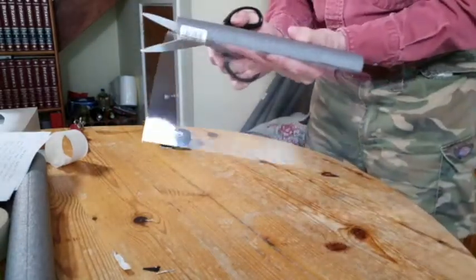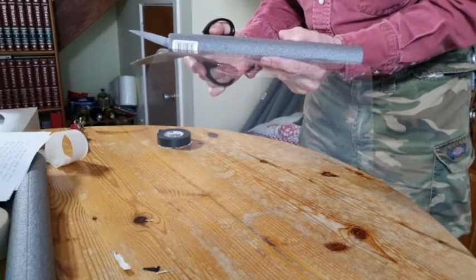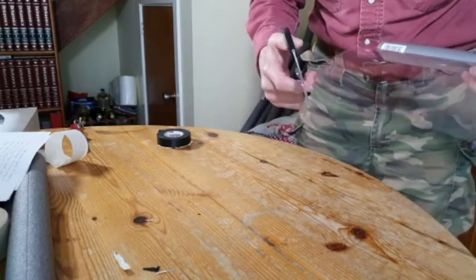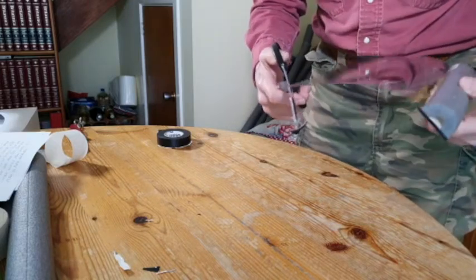Trim the corners of the visor. You can do this before or after you put the insulation tape on. Doesn't matter too much. Just trim the corners because they're just a little bit sharp maybe. It's better to be safe than sorry. I try and curve it a little bit with the scissors.